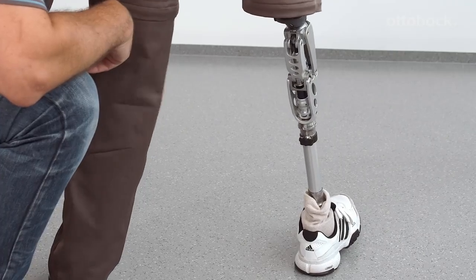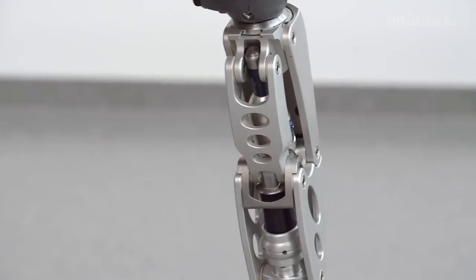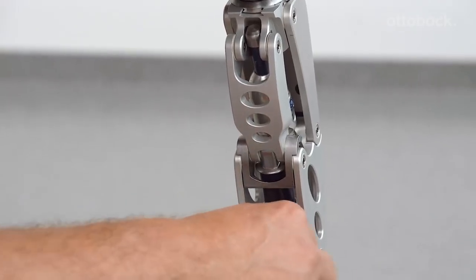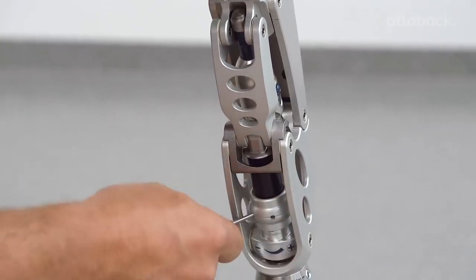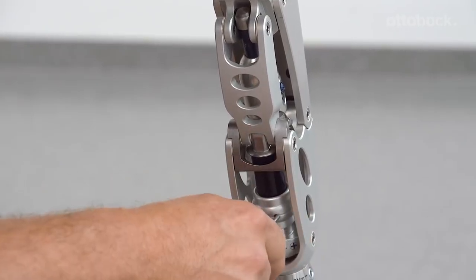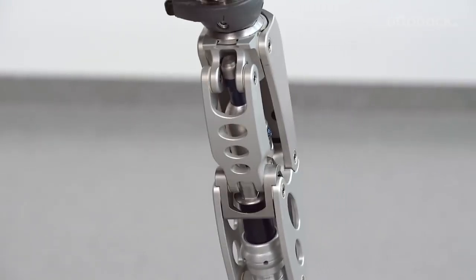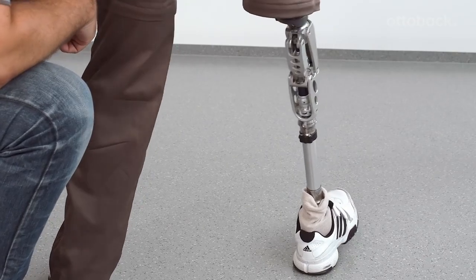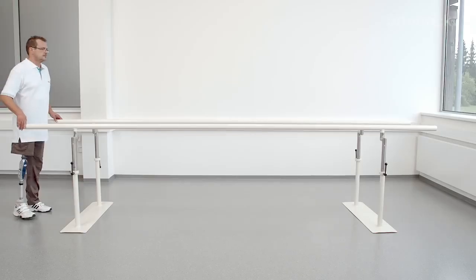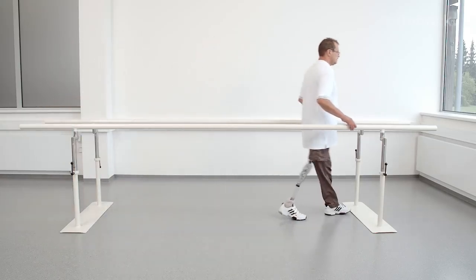At stance phase flexion, the blue rubber bumper is compressed, causing the pivoting mount to move up and generate resistance. The pivoting mount serves as a visual control for measuring the efficiency of the EBS unit. The hydraulic component of the EBS unit dampens the subsequent stance phase extension. To get a first impression of the knee, let the user walk in the parallel bars with the factory settings.